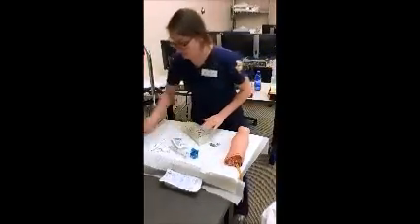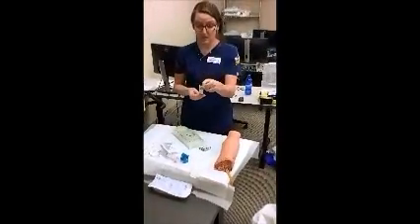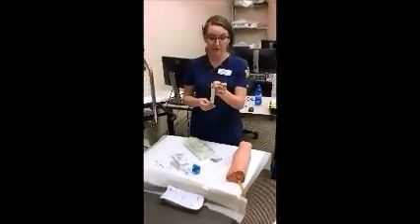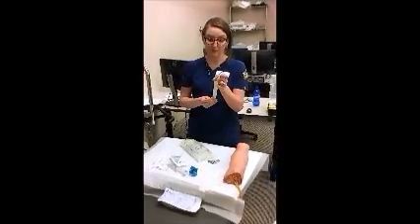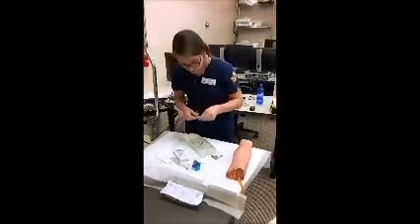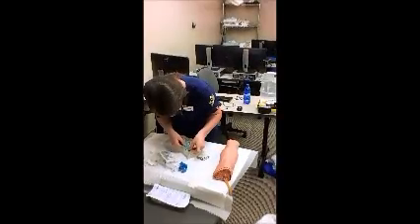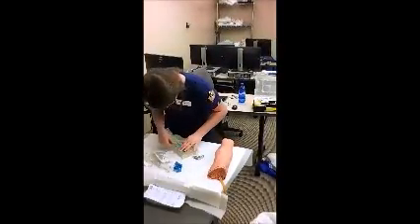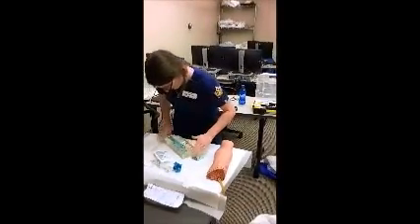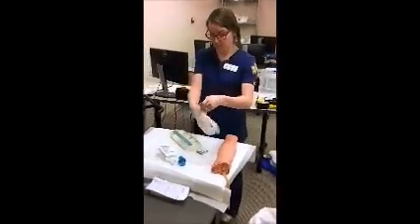We'll also go ahead and label our time strip, and this just shows the date and the hour of the infusion starts. So 4/4/18, the infusion starts at 1:30, 13:30. It shows our infusion rate and our drip rate, which is 125 milliliters per hour and 21 drops per minute. Okay. Now we can apply gloves for this next part. So we've already performed some hand hygiene.